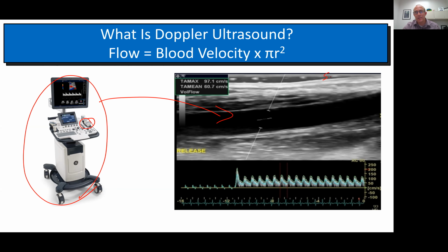So in this image, we're looking deep. So this would be like the skin up here, and we're just going deeper and deeper into the muscle. And then we have skin. This would be maybe some muscle there, probably more like fat. Yeah, it's definitely fat. And then we finally get down to the artery here. This black hypoechoic or low reflective spot is where the artery is. And then below that, now we have some muscle, right? So the ultrasound sends out these sound waves and they get reflected back by different tissues and it tells us what's there.